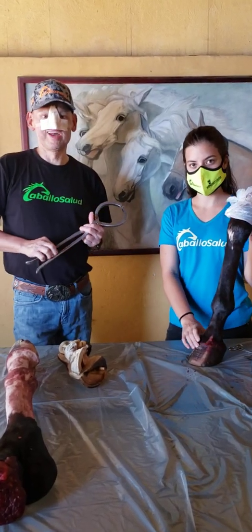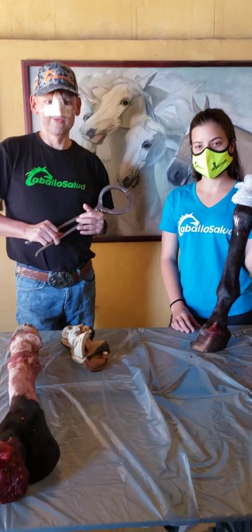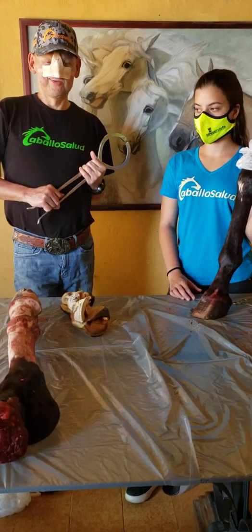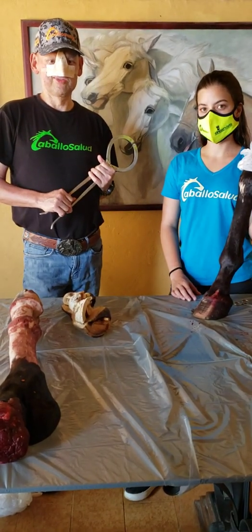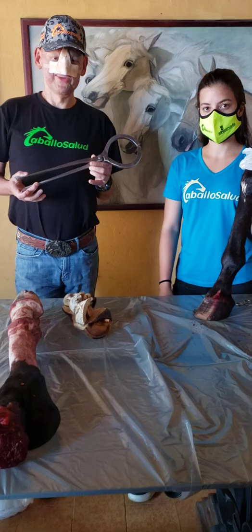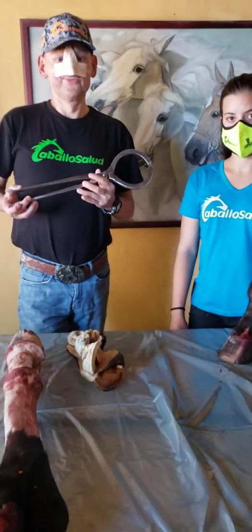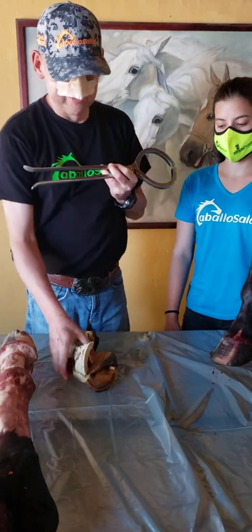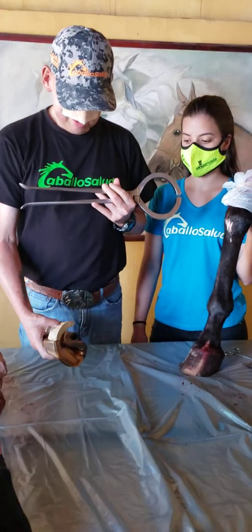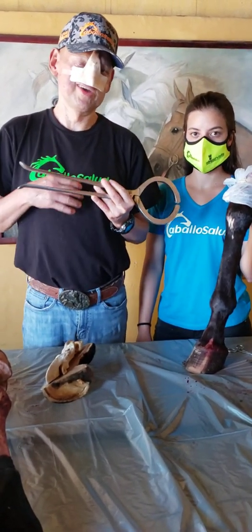My name is Dr. Carlos Rodriguez. I am from Caracas, Venezuela, inquiring veterinary practitioner. I'm going to show you on this video how to make perfect use of the hoof testers and show you which anatomical structures I am making pressure on to diagnose pain in the precise area.